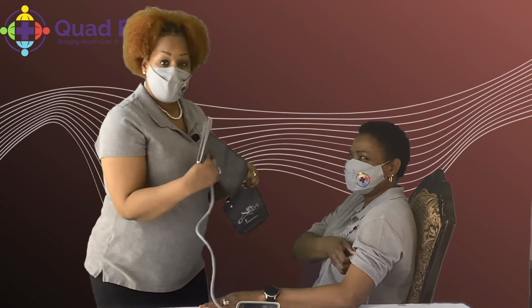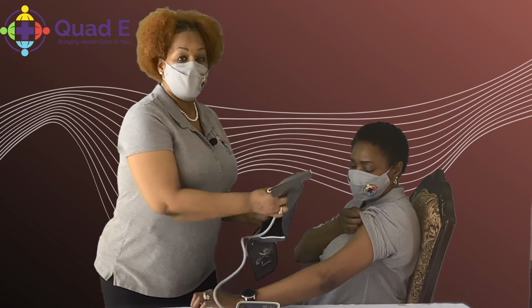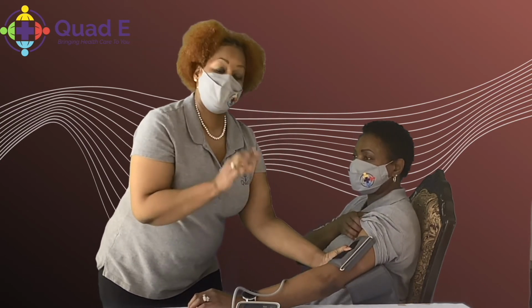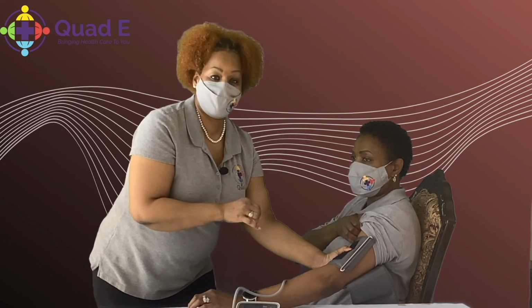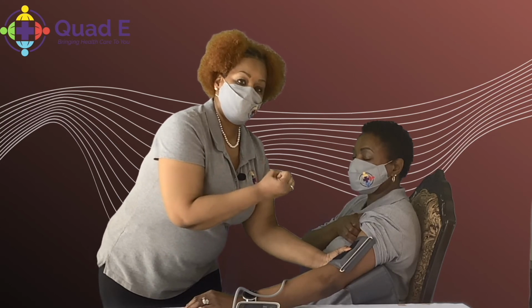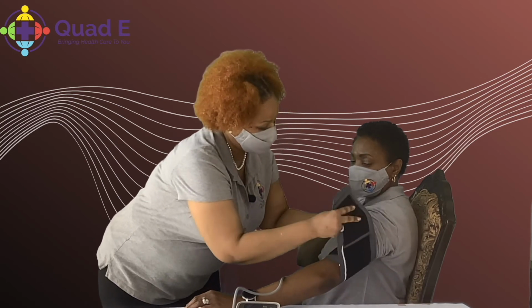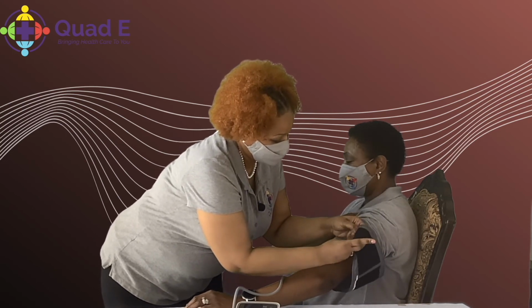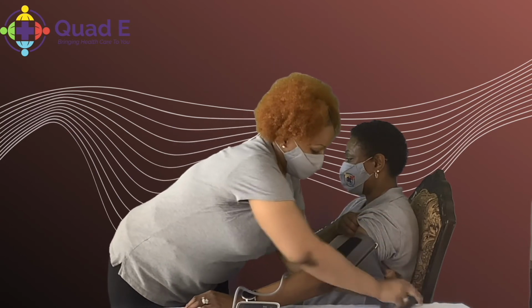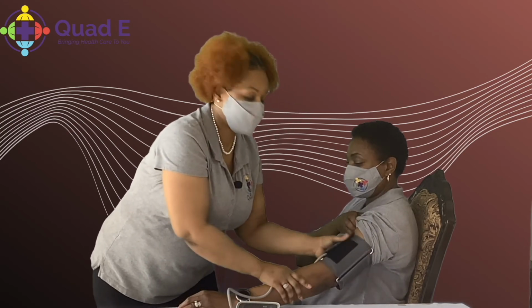So we want to start by putting it on the skin. Remember I said skin. It has to go on the skin. All right, so it has a notch. It should have a notch where you're going to be placing the blood pressure cuff. And we want to place it where we will have visibility to take it correctly. All right, so it depends on which one you have. All right, nice and snug, not too tight, not too loose.